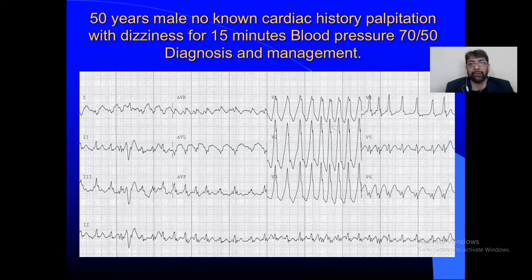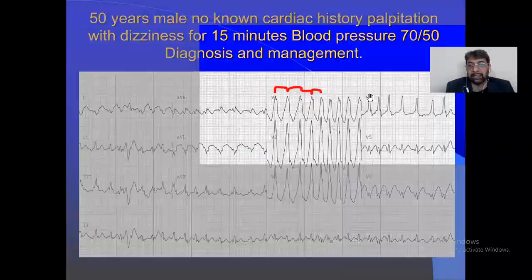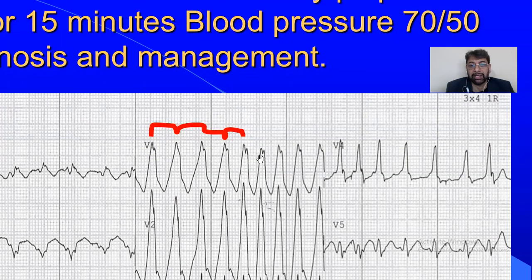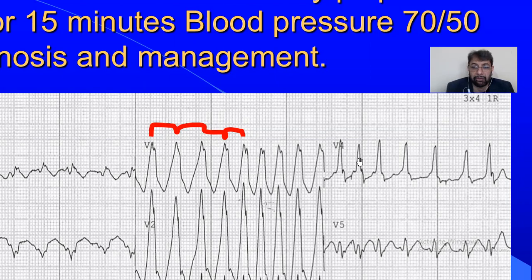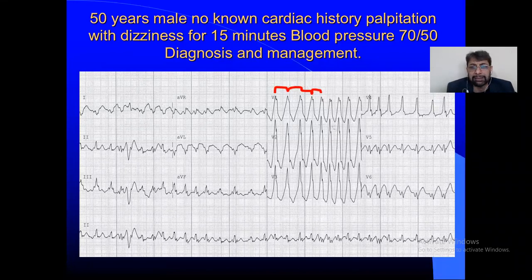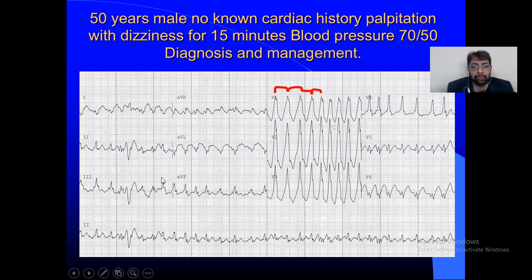Looking at the rhythm carefully, it is irregularly irregular — very clearly irregular throughout. If your eyes are habitual at identifying the R-R complexes and the R wave peaks, you can easily determine whether it is regular, regularly irregular, or irregularly irregular. The QRS morphology is broad, and the rate is very fast for a broad or mixed QRS complex. You can also see the changing morphology of the QRS.